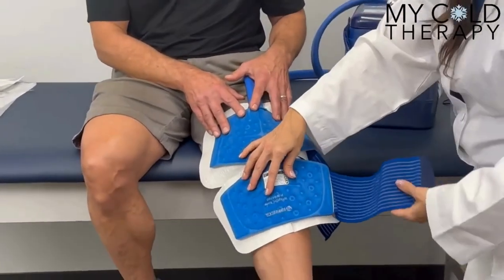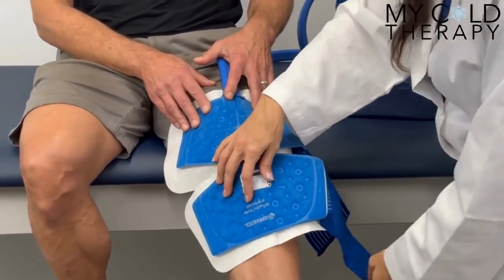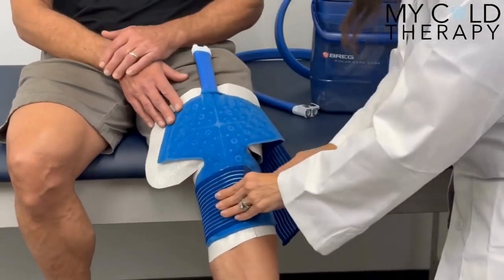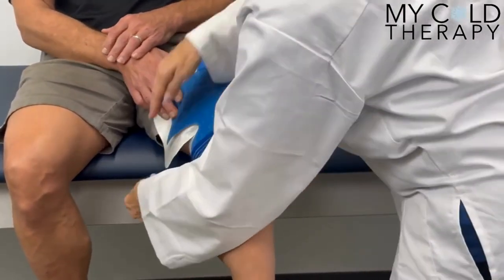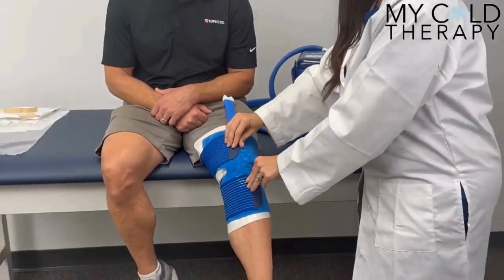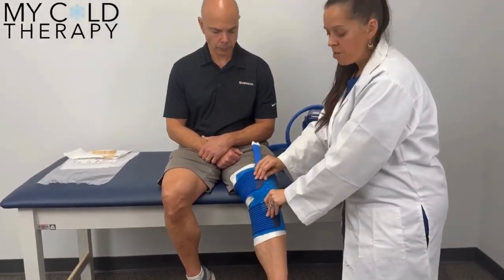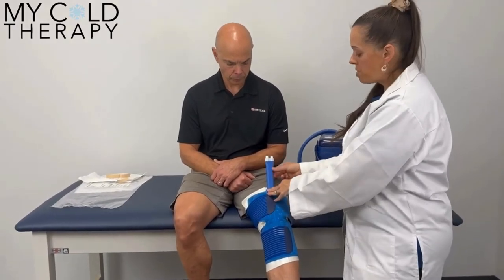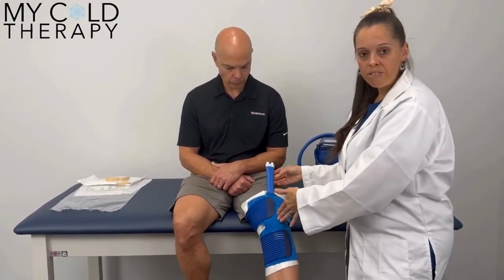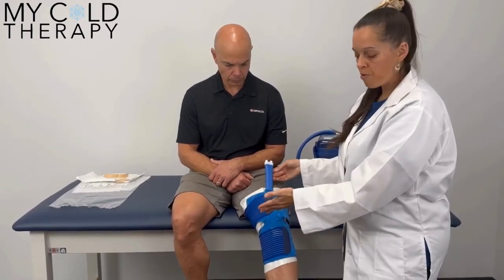The regular knee pad has two Velcro straps that are adjustable. You're going to bring the bottom one across and fasten it, then bring the top one across and fasten it. You can adjust these to loosen or tighten them depending on your needs. The hose can go up or down depending on how you have the pad positioned and which is more comfortable for you.